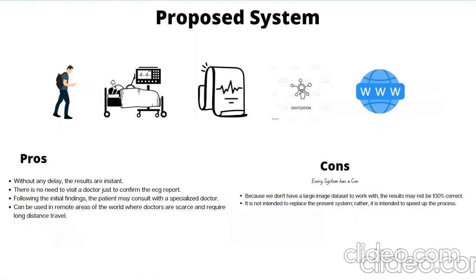In addition to that, we have a few disadvantages. Those are, since we don't have a large image data set to work on, the results may not be 100% accurate. And we do not intend to replace the present system. Rather, it is useful to speed up the process.